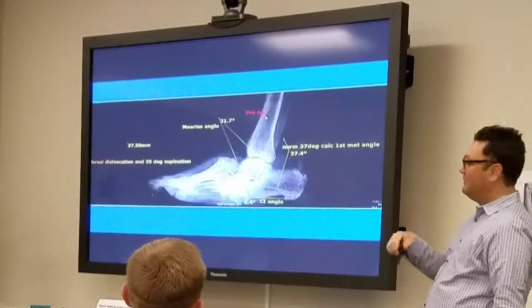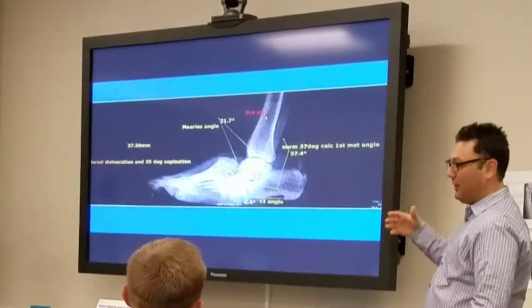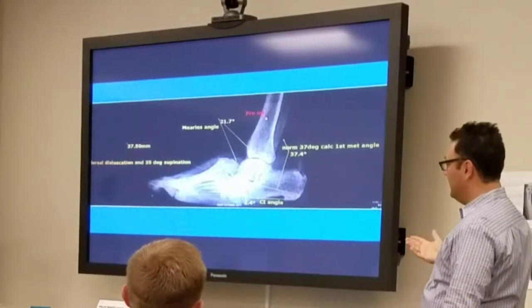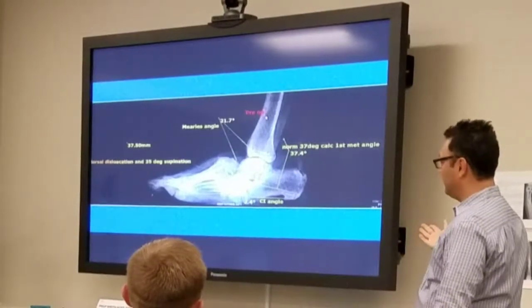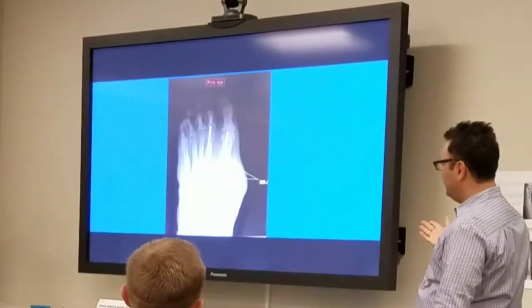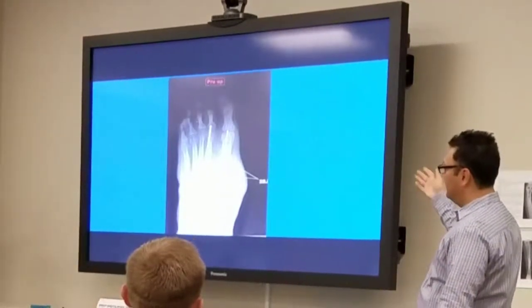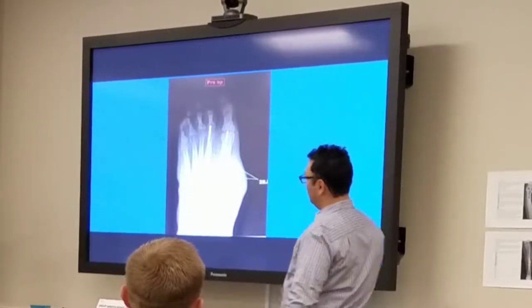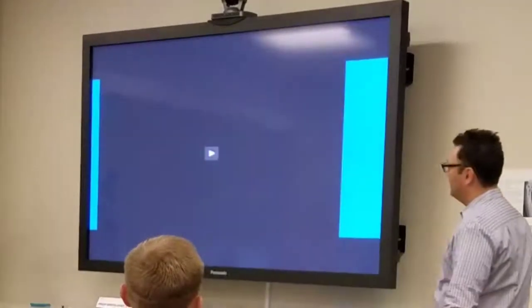The guy's better off with an amputation in my hands. The stump that he's going to have, the foot's not going to be much function anyway. So you either amputate it or you do the gradual correction. Here you've got dislocation, talonavicular dislocation. Forget the fact he doesn't even have any cuneiform, so you have a shortening of the foot as well.